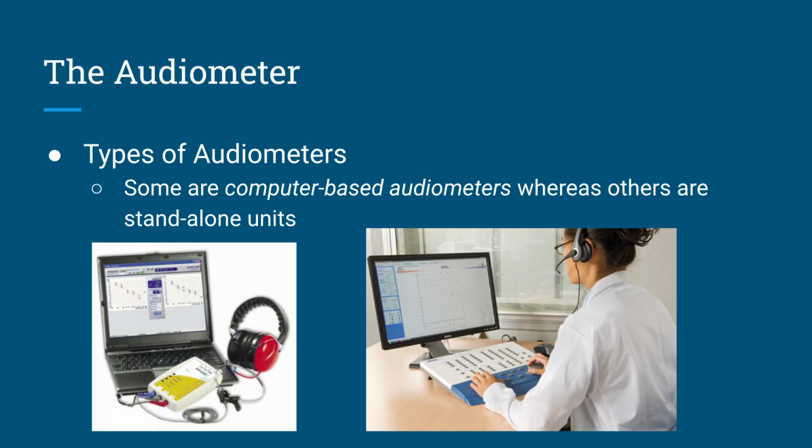There are computer-based models for audiometers where you may only have a box where you plug in your headphones, microphones, and response button. And you may also have a specialized hybrid unit like you see on the right side that feels a little bit more like a traditional audiometer but uses a computer screen. It's actually a computer-based audiometer. It just has the feel of a traditional audiometer.